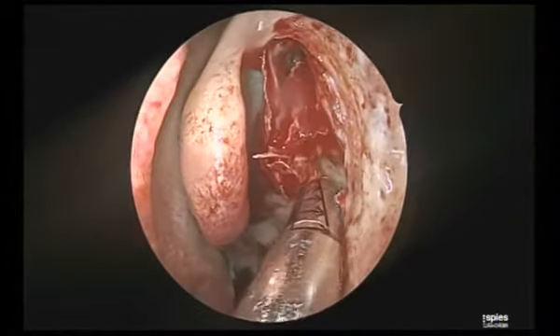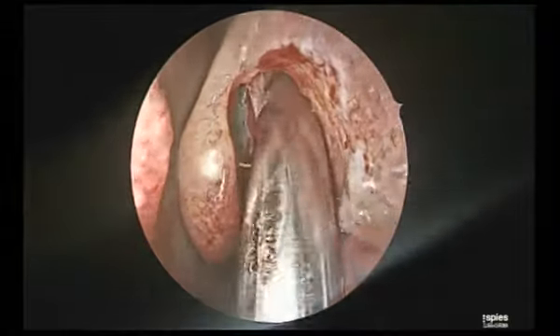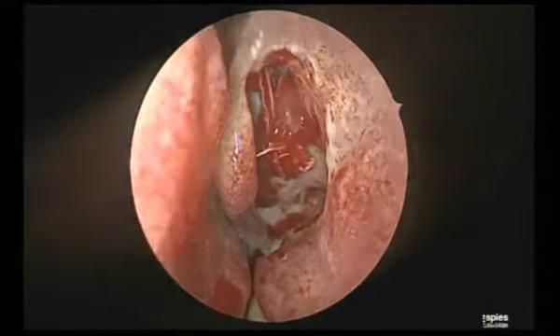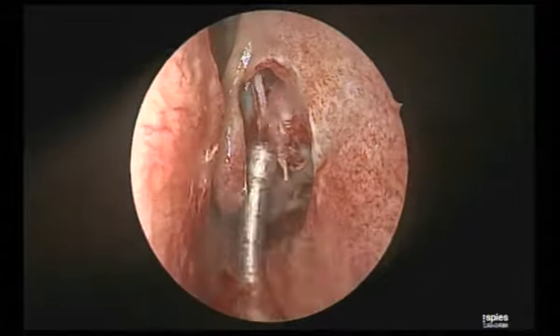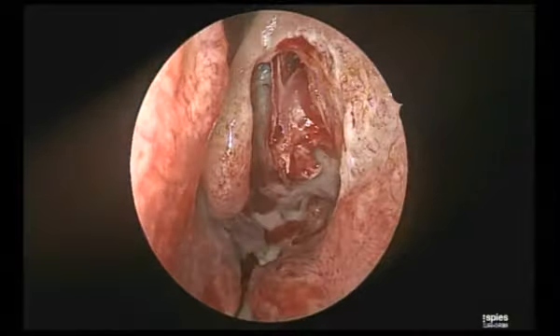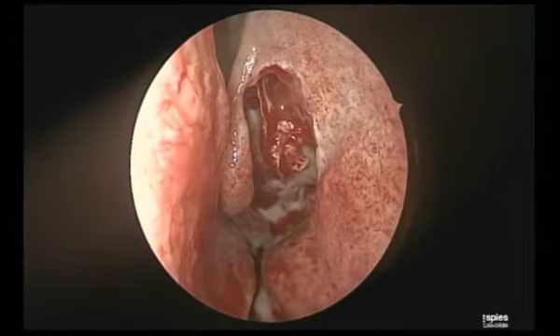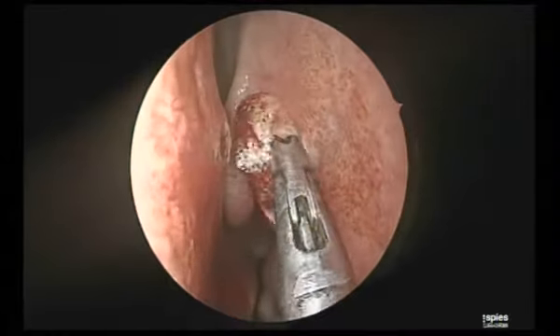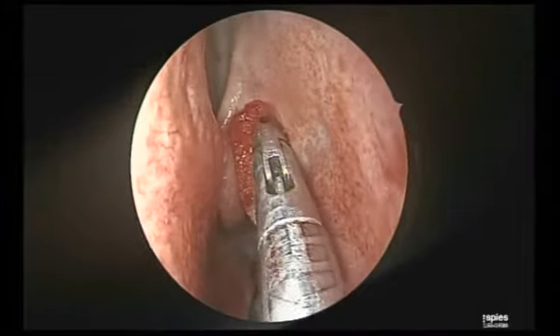And the most important thing in the entire surgery, believe me, see now, why are we doing FESS? We are doing FESS for the resumption of the mucociliary activity. So you need to preserve the mucosa. So everywhere you need to spare the mucosa from stripping. That's most important. It should leave a completely mucosalized cavity at the end of the procedure. So the walls of the sinuses should not be stripped, obviously not the air cells. So the lateral wall, he's making sure he's not going to strip the mucosal blanket anywhere in the sinuses.